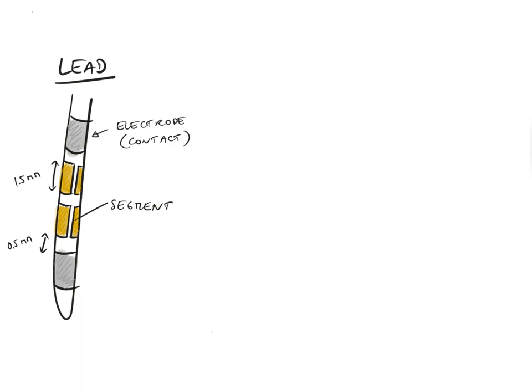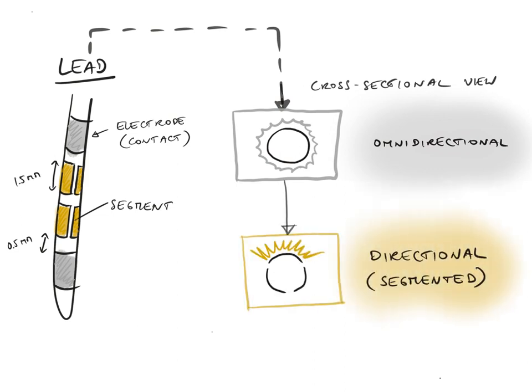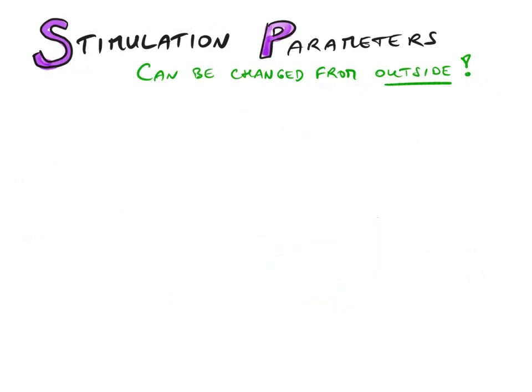And with directional steering, in the current lead developments, the middle 2 contacts are segmented, which means if the stimulation is activated, the current is not going in all directions, but specifically in the direction in which you want. So with the traditional, in this case silver-colored contacts, you get omnidirectional stimulation, current going in all directions. With directional steering with segmented leads, you can selectively activate or deactivate a specific segment, which allows for getting the current in the direction in which you want it, and thereby avoiding current in the areas in which you don't want it. And the reason why we want this is to increase our therapeutic window.